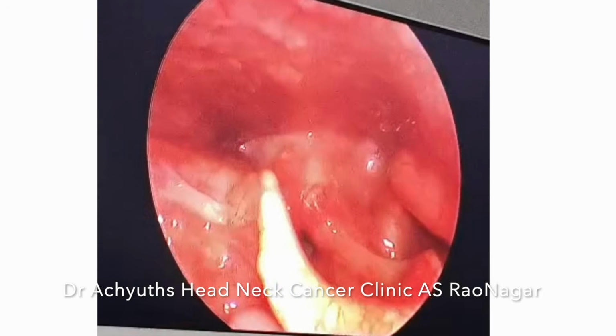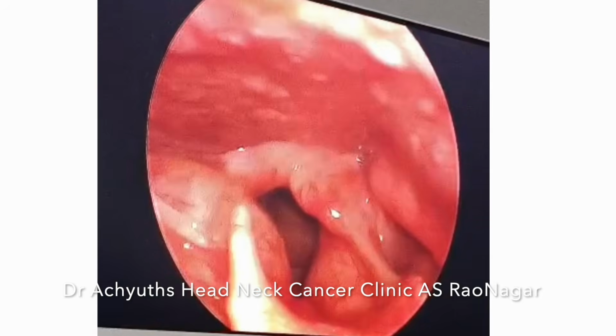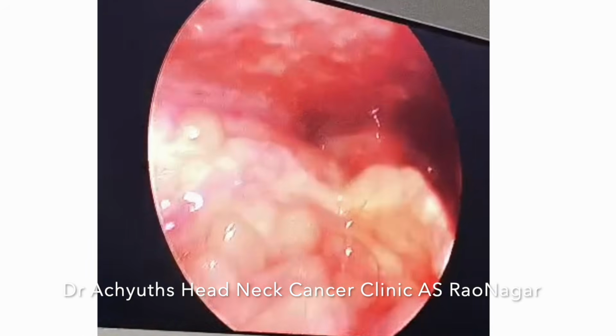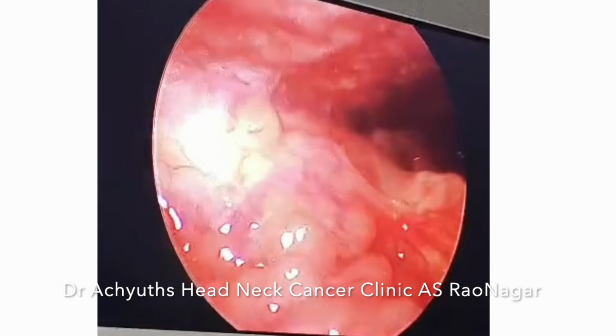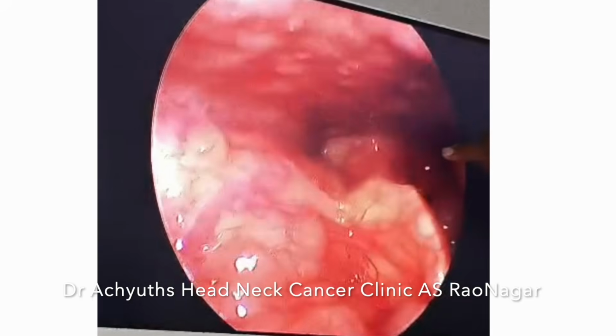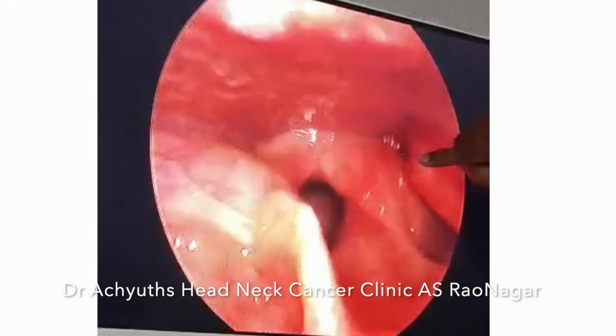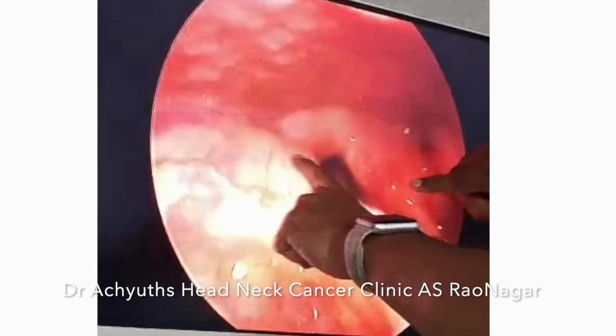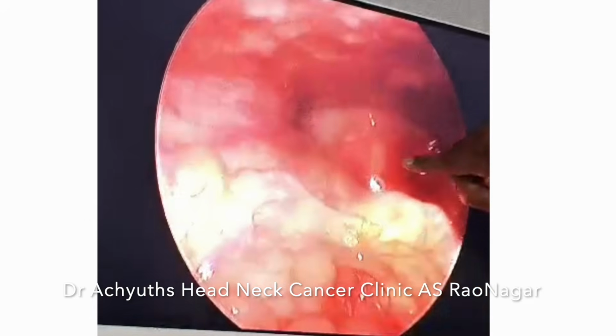On video laryngoscopy, you can see that there is a globular swelling which is present inferior to the pharyngoepiglottic fold, which is partially involving the vallecula and the lateral pharyngeal wall. The movement of the vocal cord is also a little restricted because of the mass effect.